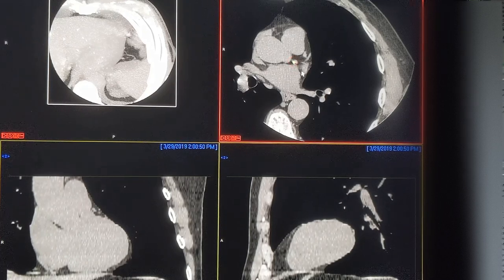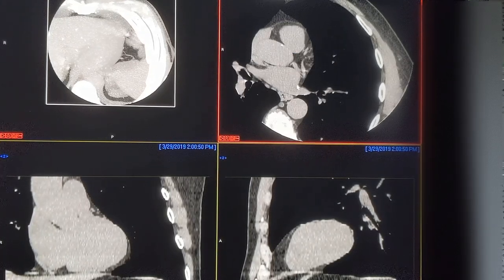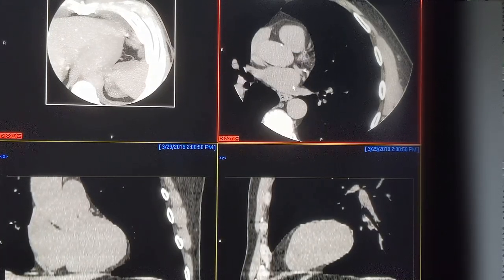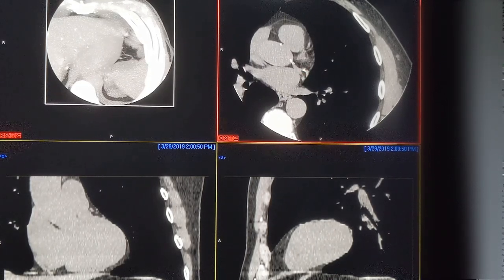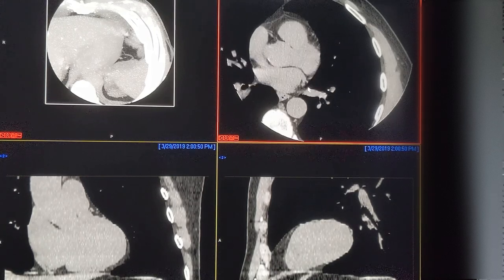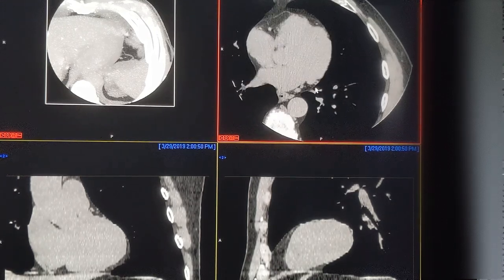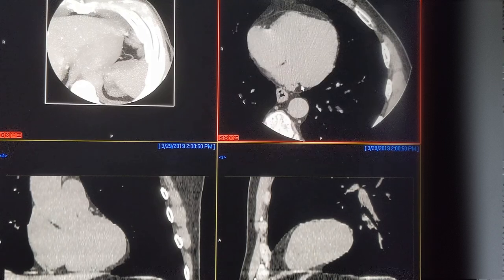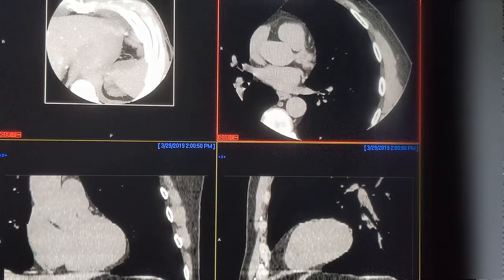It will make sure it marks everything. Anything that is within my red circle that appears bright or white within that field, and picks up to the relative threshold level, will be scored as positive for calcium. The amount of density correlates to the amount of calcium volume.